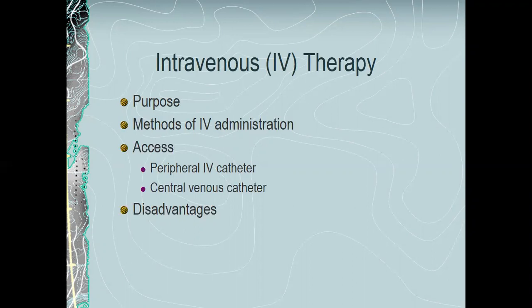IV push medications are also intermittent. So they are not hung up. They're given through a syringe in a push. So IV therapy, as I said, mentioning with primary, secondary, and IV push medications, they can be continuous or intermittent.